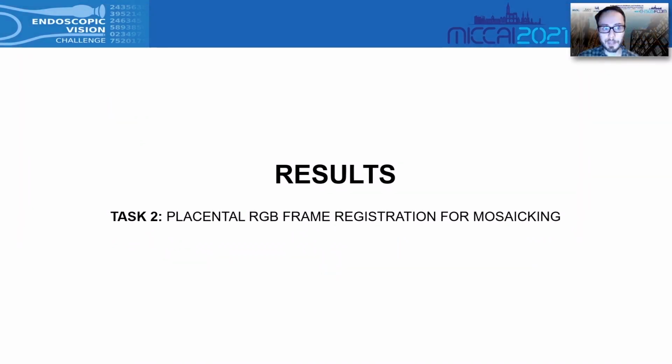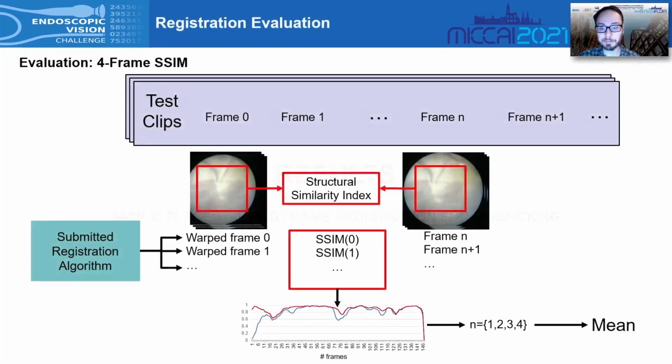Thank you, Alessandro. Before we present the registration results, let's remind what's the logic behind our registration metric. What we're trying to accomplish is to measure the consistency across different frames between different registrations. So the different teams perform pairwise registration between different frames. And if we accumulate these registrations through consecutive frames, we will observe a drifting error.